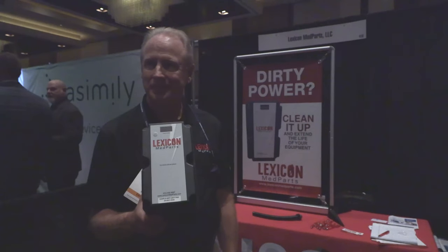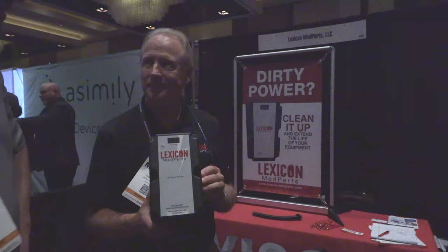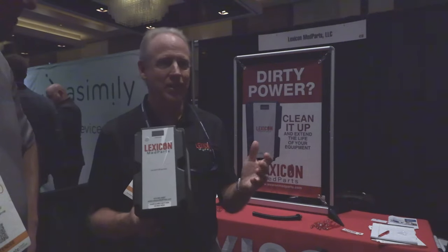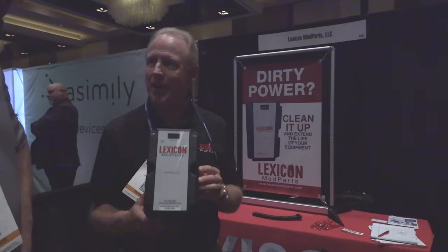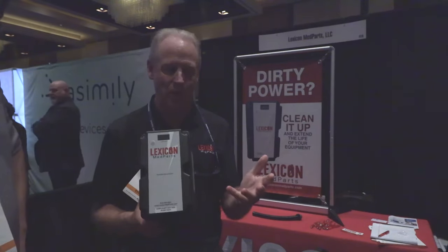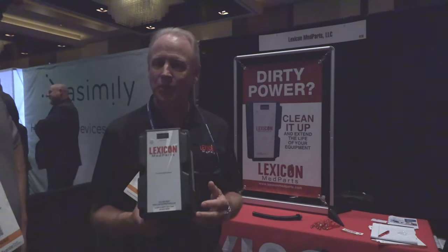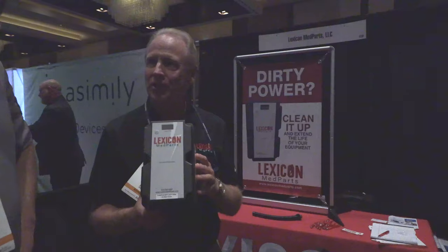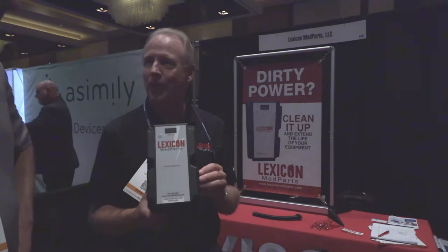About how much does one of these units cost? Less than five thousand dollars — that's one hell of an insurance policy on a million-plus dollar piece of equipment. On your CTs, say a CT goes down eight times a year on average — if this can take even one event down, look what you've saved on service parts and downtime. In most cases it's going to cut your service expenses in half and extend the life of your components and your glass.